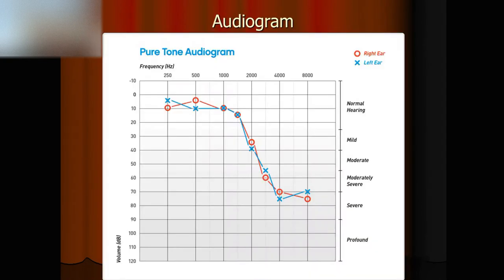Eventually, we will see a result like this. The x-axis is the frequency in Hertz: 250, 500, 1000, 2000, 4000, and 8000. Those are important frequencies for us to hear speech, music, and natural sounds, etc.